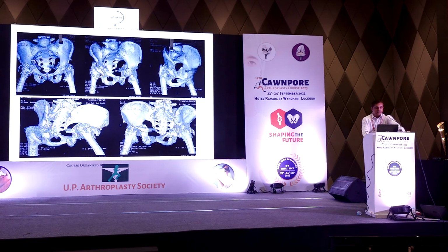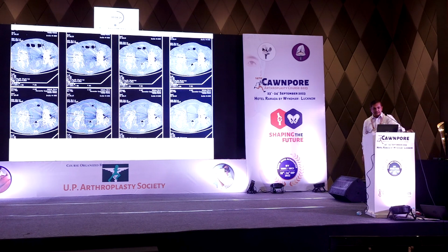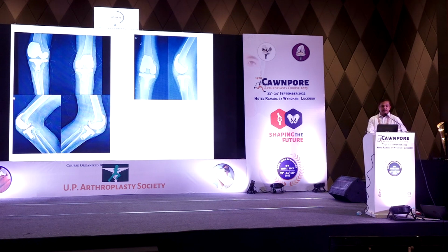Then we got a CT, and on the right side, there is almost no acetabulum. There is a thick bone like iliac crest. Then we did the knees. You didn't do anything on the right side at this stage? So I'm coming to that.